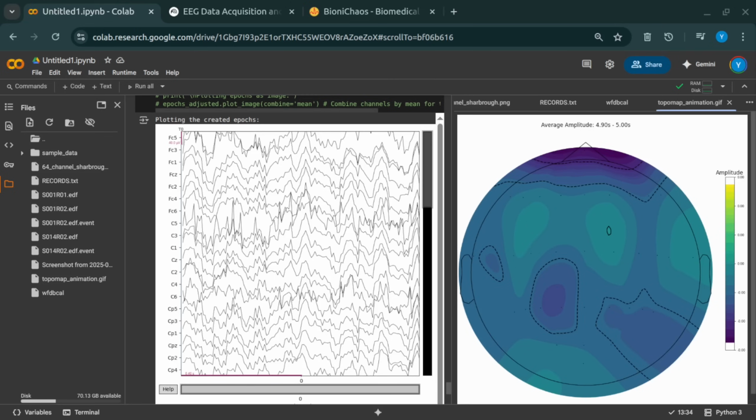Kind of. It's like giving a specialized tool a slightly different but compatible input so it can still do its amazing work. Okay, let me try and summarize. It really sounds like trying to teach two different dialects of the same language to understand each other, or making sure all your puzzle pieces are genuinely from the same box, as you said. That's a great analogy. Yeah. Because if the coordinates are off or the names don't match, your map is just meaningless colors.